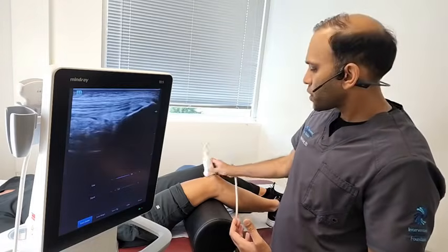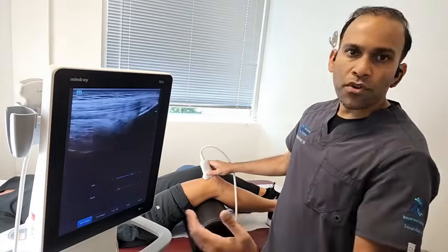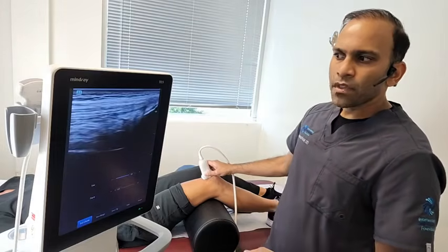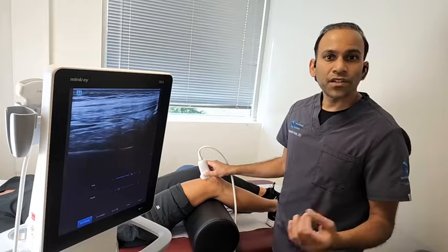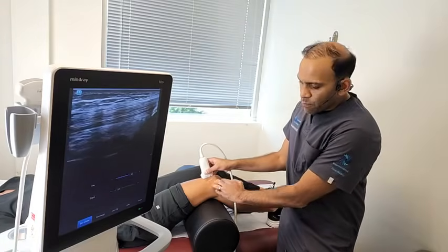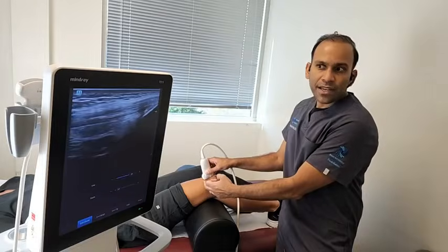So when I start scanning a knee, I always start at this front compartment called the anterior compartment, and I start scanning north of the kneecap, which is right here. From here I get a good view of whether there's any major inflammation going on inside the knee. This area higher up than the knee is a pocket, a window where we can see if there's inflammation coming from within the knee. Because when there's inflammation or swelling inside the knee, that can pool up here, because there's a capsule, a kind of balloon, that surrounds the knee joint, and that balloon goes as high as this area over here.